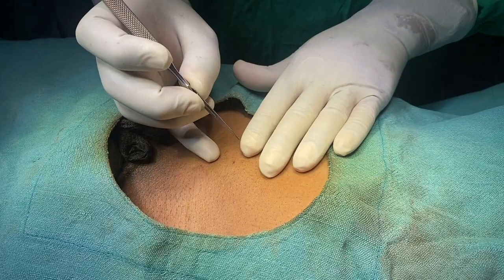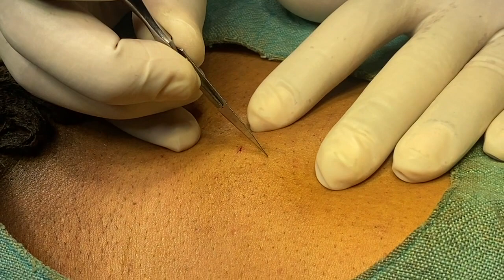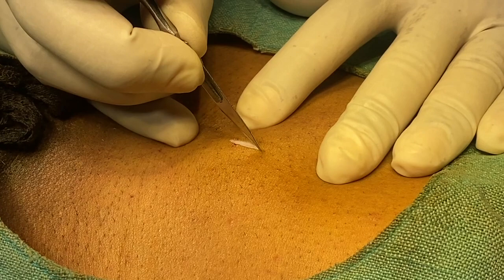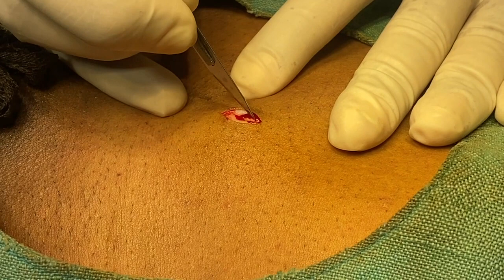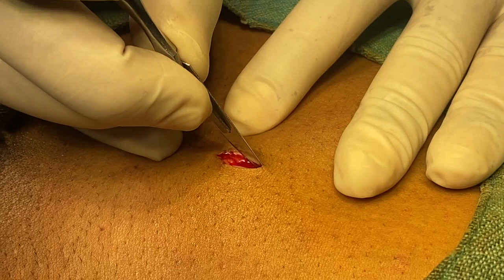In a patient where adrenaline is not contraindicated, we prefer to give lignocaine with adrenaline because that gives us good haemostasis. The incision should be very gentle, through skin, subcutaneous tissue, and then the rectus sheath — we have to incise the rectus sheath.